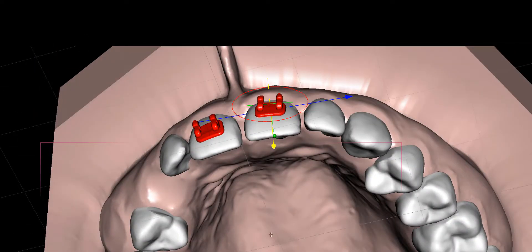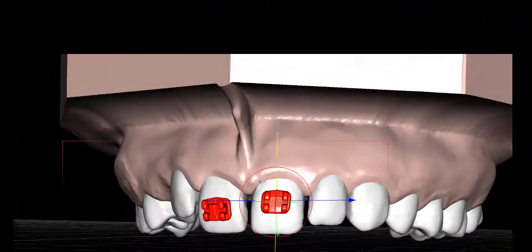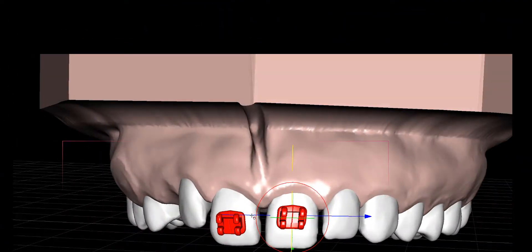It responds to the same parameters of being centered and the angulation. There is no change in the two bracket placements except for height, and obviously an MBT bracket will have different torque values than a Roth bracket.